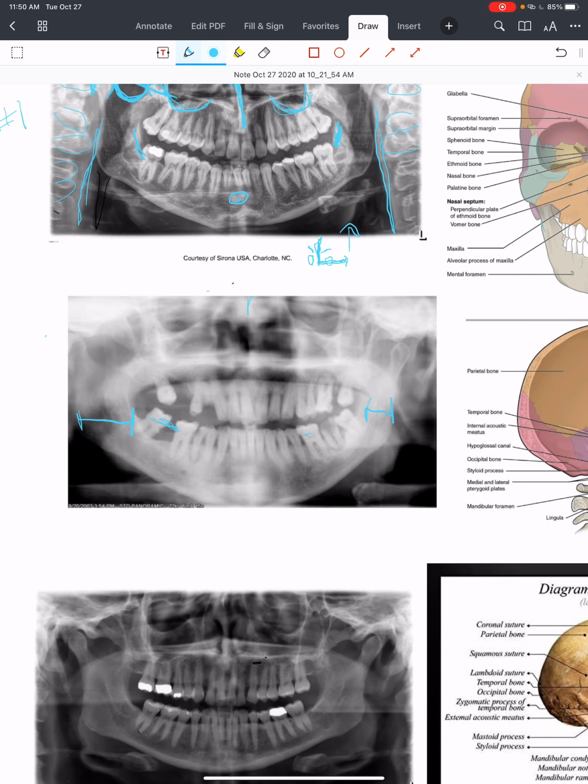But despite all these errors, we can still identify some landmarks here. So first, I want to talk about this floating structure on the bottom region of the radiograph, and this almost radiopaque thicker structure is the hyoid bone.